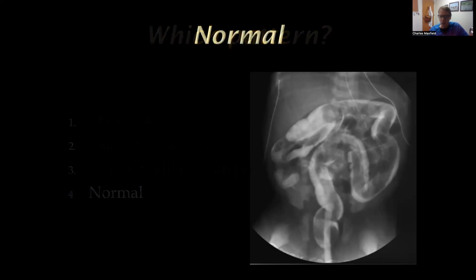Okay. So what are we going to do with a normal contrast enema? Well, usually normal is good, right? But in this setting, realize that to have gotten to this point where we're doing a contrast enema, we must have started with a sick baby who was distended and not pooping and not eating.